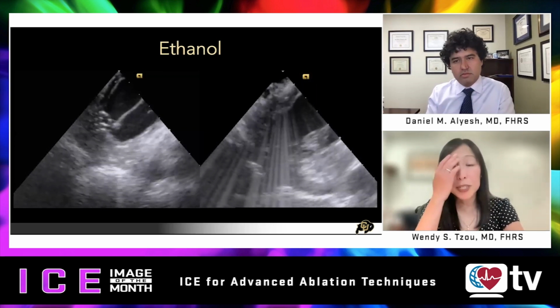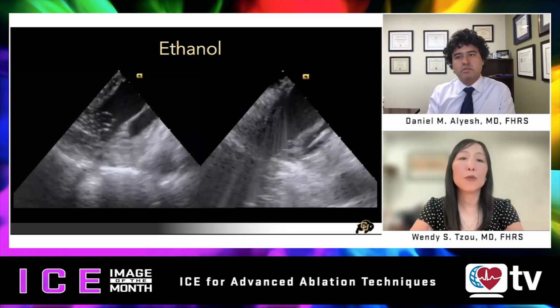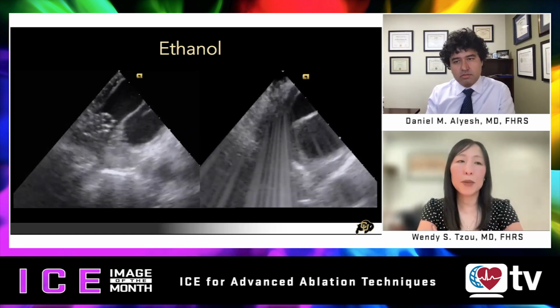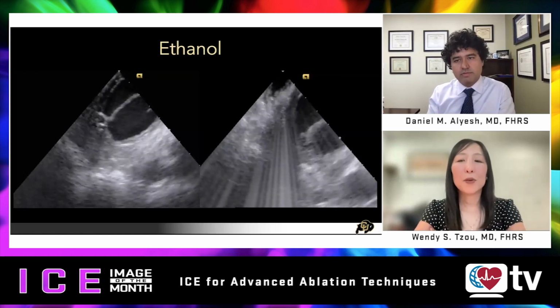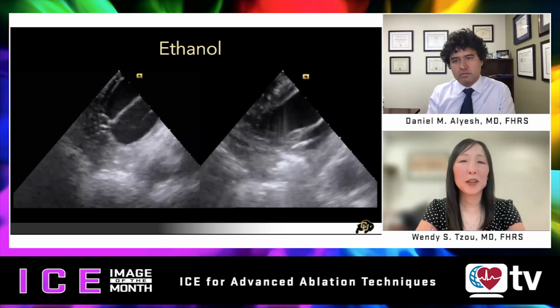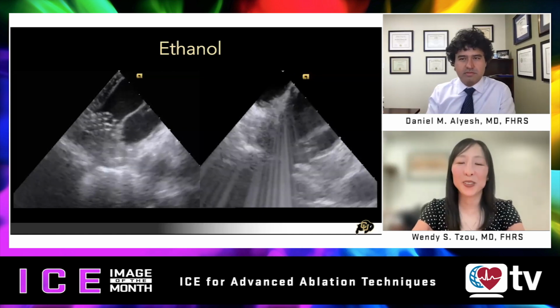You do run into the limitation of creating a bunch of edema in a single procedure, in which case subsequent efforts with the same modality become more limited. So it depends on the patient and the context, the rapidity with which I progress to these alternatives. Sure.